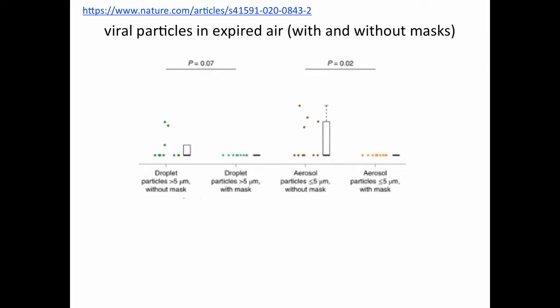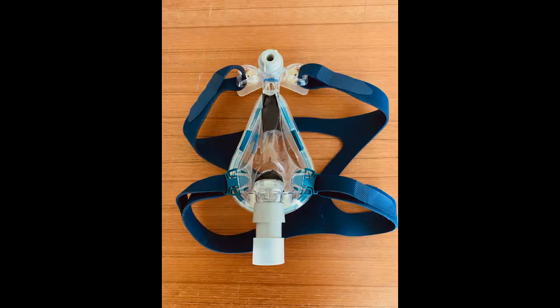Our goal will be to redirect the expired air through a filter before releasing it into the environment. Step one is to block all the air holes. I did it with tape in this slide because I didn't want to ruin my mask, but if doing this permanently, I'd probably use a silicon-based glue to plug the holes.